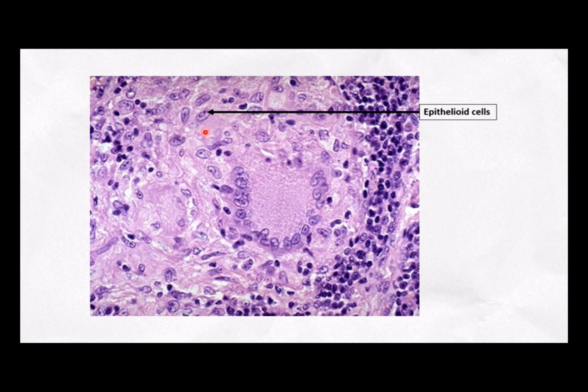The boundaries of these cells are not clear, and the nucleus is round or oval, and staining is very light. The cytoplasm is light and rich. This cell is a Langhans cell. Langhans cells are derived from the fusion of epithelioid cells. The cell has a large cell body and multiple nuclei. The nuclei are arranged in a garland or horseshoe form or assembled together, and quite resemble those of epithelioid cells. The cytoplasm is red stained and abundant.